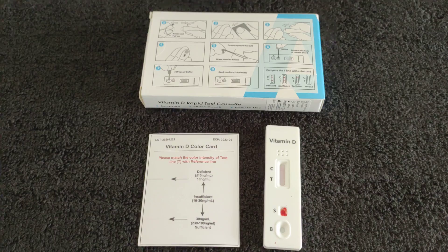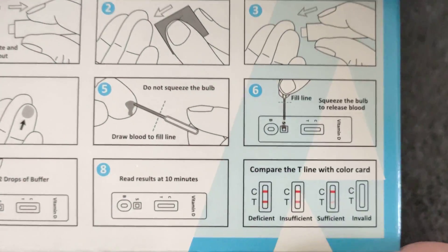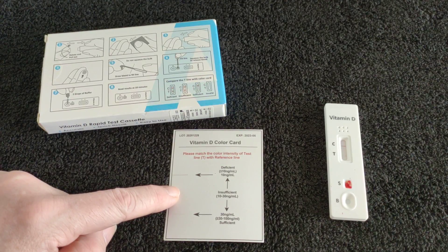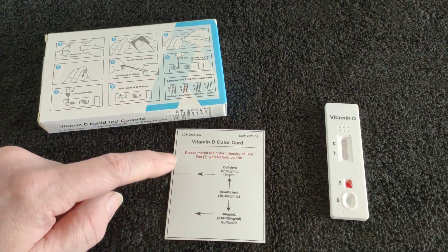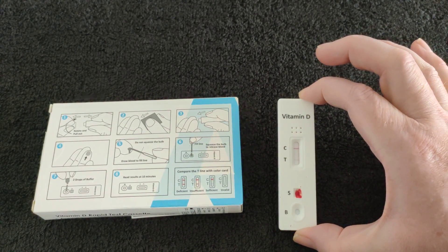And you want your control to definitely be there, which is C. This colour card seems to be wrong — I think that should be bright red, the most red. Insufficient — looking at this. Actually it should be the second reddest. Sufficient should be the lightest. Deficient should be the strongest red. So this seems to be missing. I'm at the five-minute mark and I think I'm going to be normal. Sufficient.